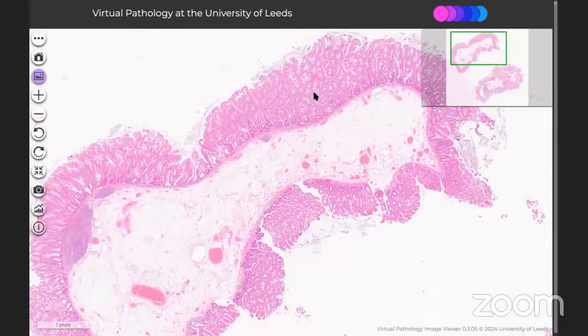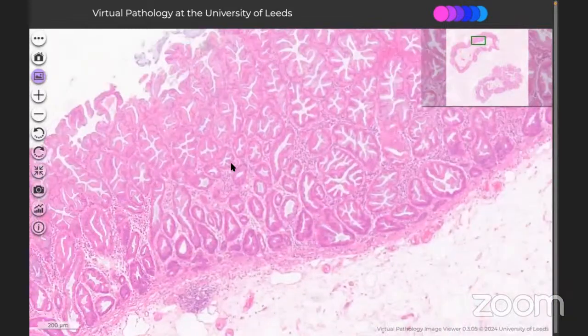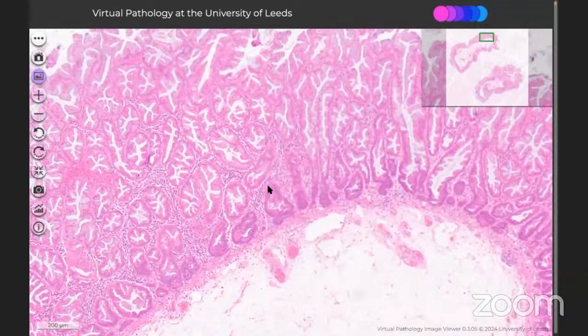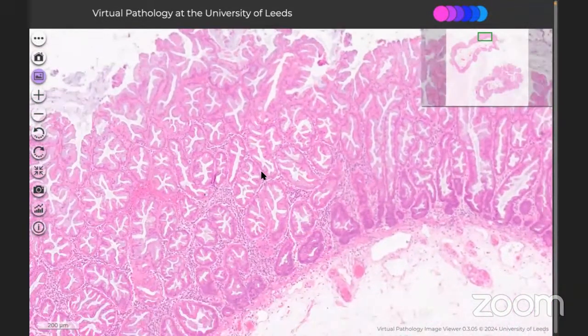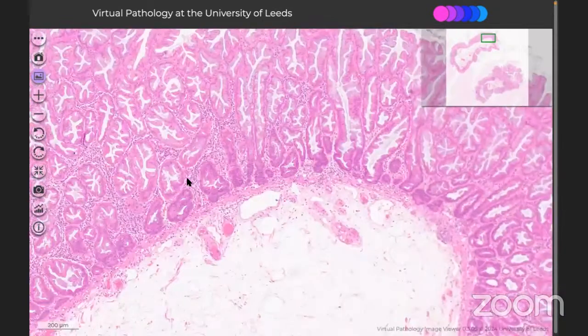You can see some genetic alteration, predominantly BRAF mutation, in this kind of polyp, and the carcinoma that develops from this is known as serrated pathway associated carcinoma, and that molecular pathway is given in an elaborated way in the WHO GI fascicles. So you can refer to the chart.